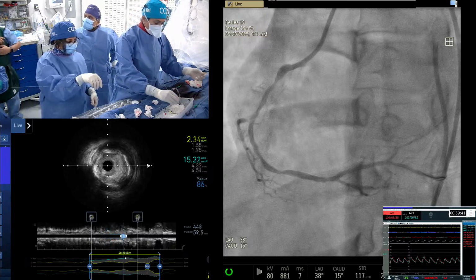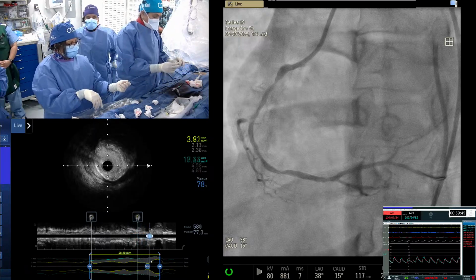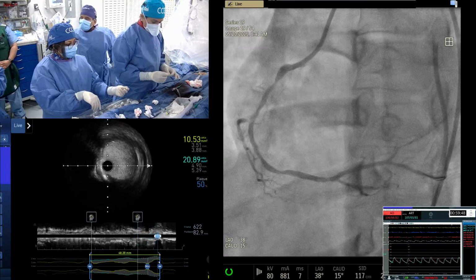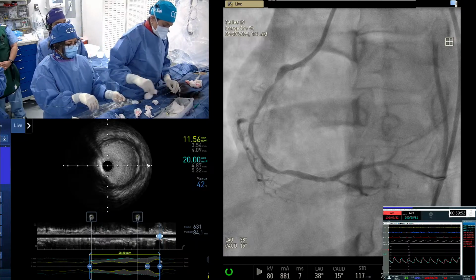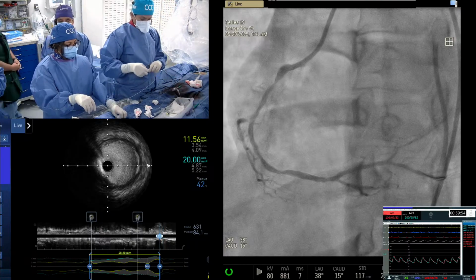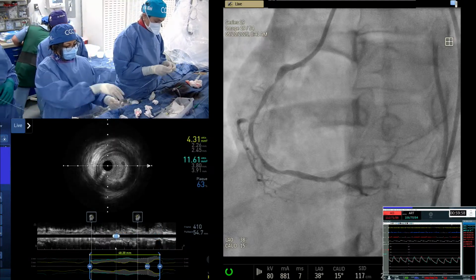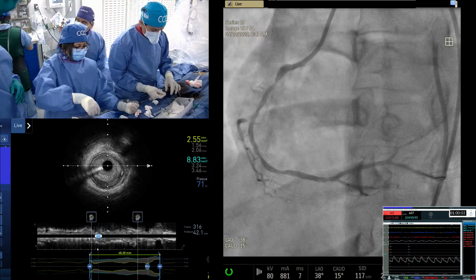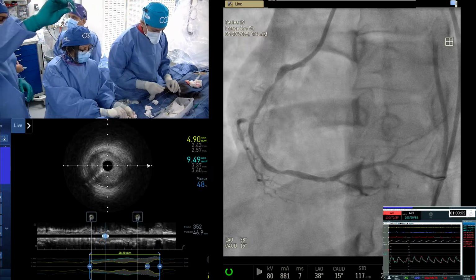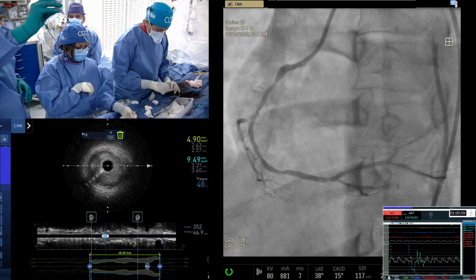So Shockwave has a newer one, right? Yeah, that's the Javelin. Then you have Abbott, then you have Boston Scientific, and there are a few other companies. Many of them are coming, and I would say that by next year, the $12 or $13 billion J&J spent on Shockwave will become minuscule once you have four or five competitors in the market. That is what will happen by mid next year.